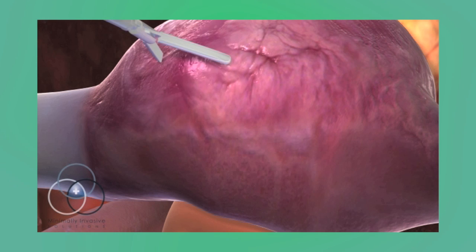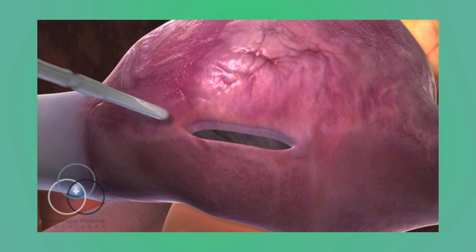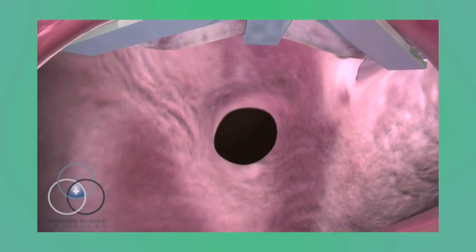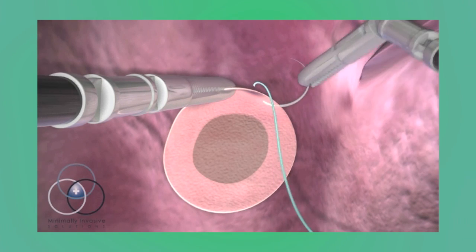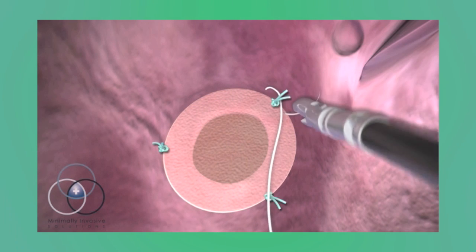Once the heart has been stopped, the surgeon creates an opening in the atrium to gain access to the defect. Using the third instrument arm, the surgeon lifts the roof of the atrium, exposing the hole. The surgeon quickly and carefully repairs the hole using a patch, in a similar way that a patch is used to repair a bicycle tube.